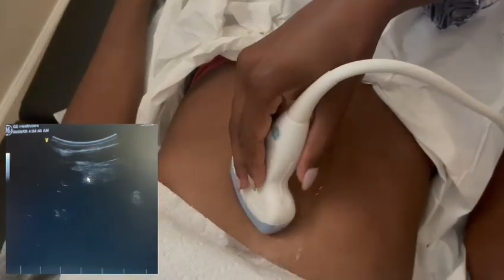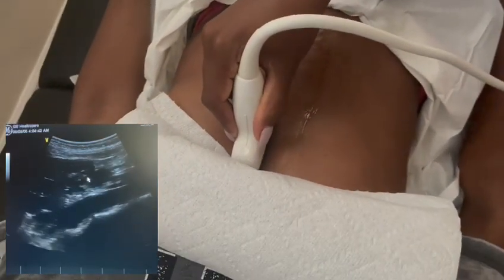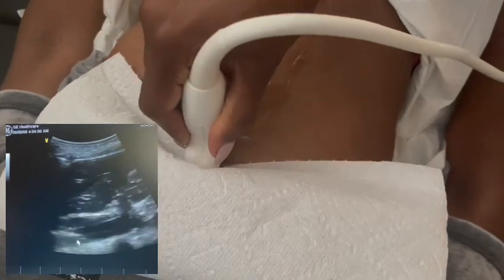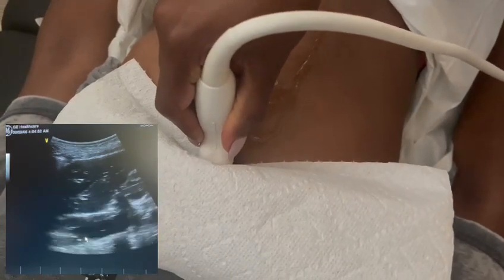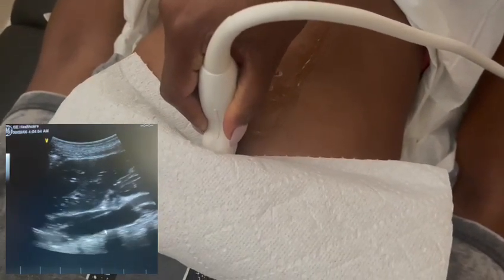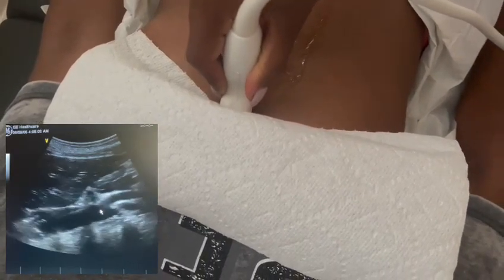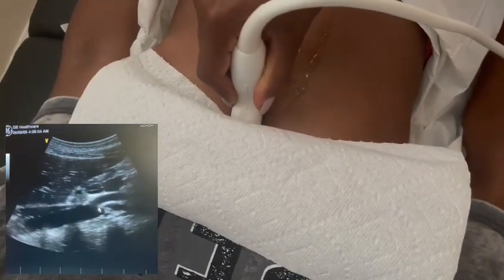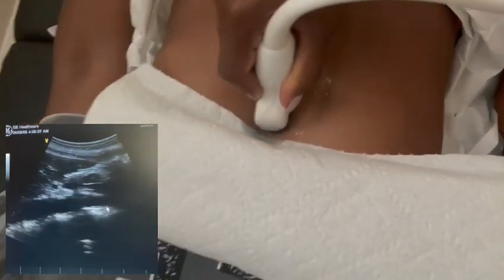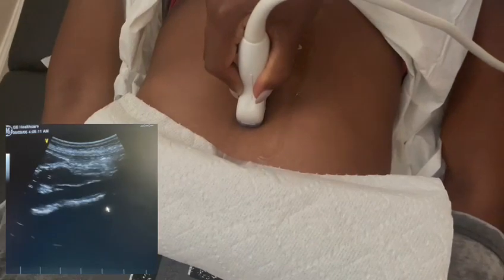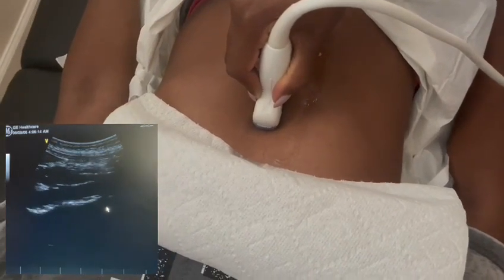Now I'm going to do a sagittal aorta. Deep breath in and hold it for me, please. Looking at that proximal aorta right there — there's a little shadowing coming off from the rib, but I'm going to keep following that down. You can see the celiac taking off right there, and then her SMA is right there. I'm going to keep following that aorta in the sagittal segment down. She has a big bubble of gas right there; I'm going to try to push past it and fix my gain a little bit so I can see better.